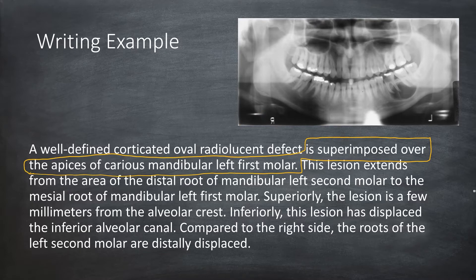Now we are describing the location of the lesion — it is superimposed over the apices of the carious mandibular left first molar. Create the habit of using the word 'superimposed.' It means that the lesion may be buccal to the roots, lingual to the roots, or around the roots. We do not yet know the relationship of the lesion with the roots. A panoramic radiograph is a two-dimensional image, so we have to mentally think if this lesion is actually associated with the roots.